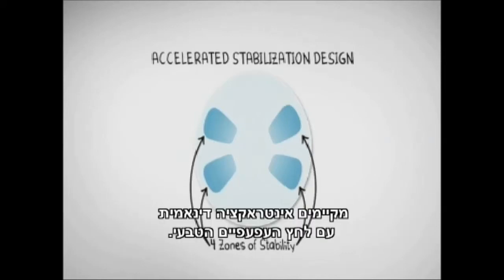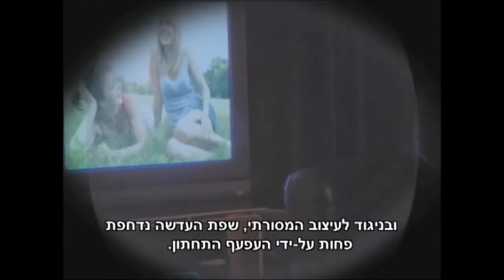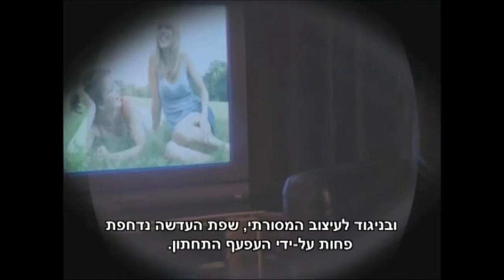ASD's four zones dynamically interact with your natural eyelid pressure. Every time you blink, that pressure actively realigns your lenses, helping to keep them right where they need to be. And unlike traditional ballast designs, the lens edge is pushed around less by your lower lid.